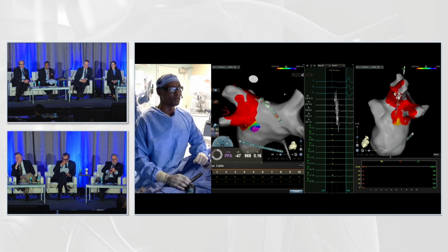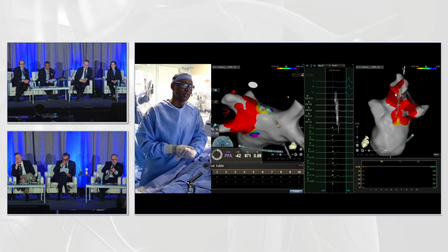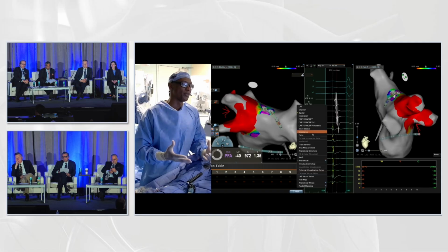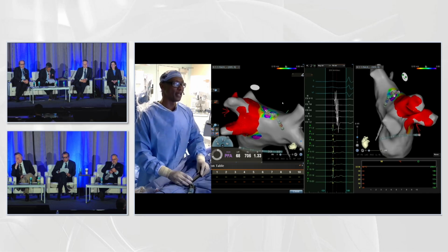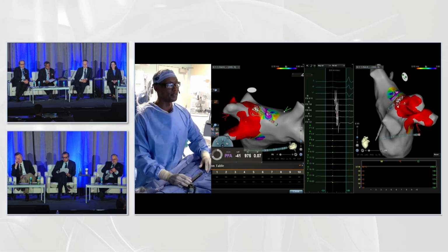It's definitely the fluoroscopy. And I think the integration with the mapping system is actually the strength of this system. The workflow for me has not changed much from RF to this. And then I can immediately, if I have a flutter, I'm in the same system and I change out to an RF catheter in order to do the flutter. So that's pretty much the case here.